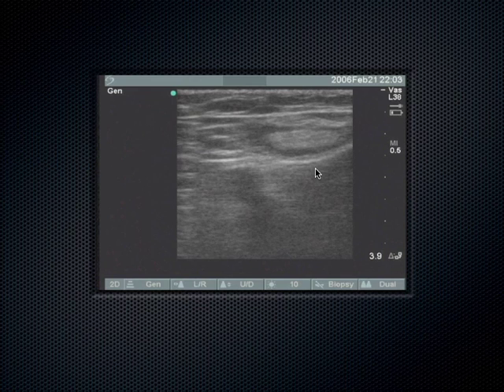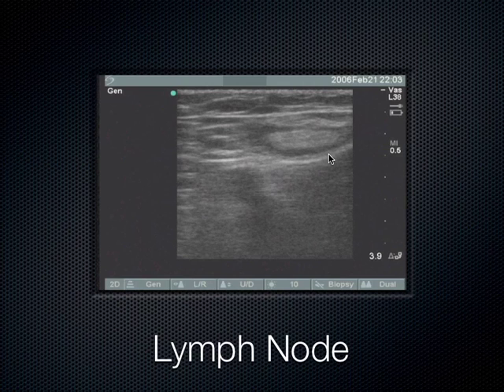This is a very enlarged lymph node, and we see that in cases of infection. So there's an infection downstream, down the leg, maybe somewhere around the calf. The skin's kind of red, the leg is kind of swollen, and then you don't see DVT, but you see a really enlarged lymph node. It helps sway you clinically towards cellulitis or infection and away from DVT. That's an inguinal lymph node. Correct. Inguinal lymph node.